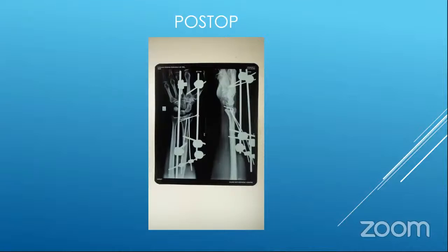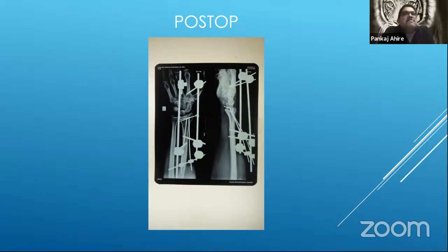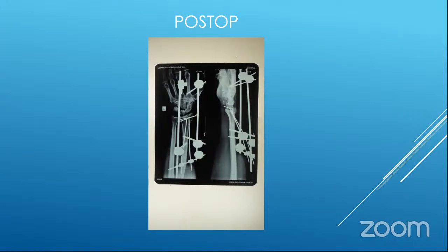So no matter how much you triangulate, essentially, whether you had put the fixator or not wouldn't have made much of a difference is the point I'm trying to make. In this particular case, I'm not talking about the remaining 199 cases the gentleman has done, and I'm sure he must have had positive experiences with them. What I'm trying to do is a case in point that we are relying on a frame which has got only one pin on either side.